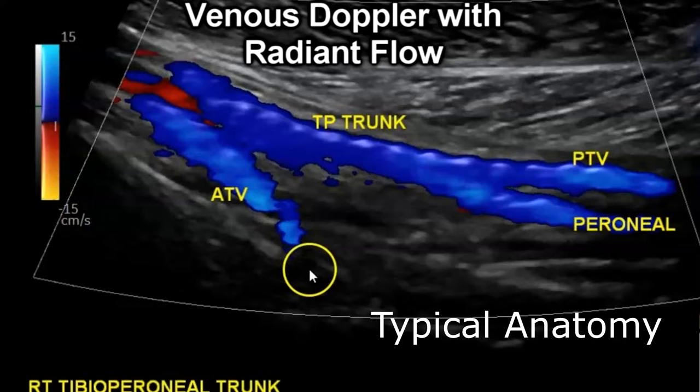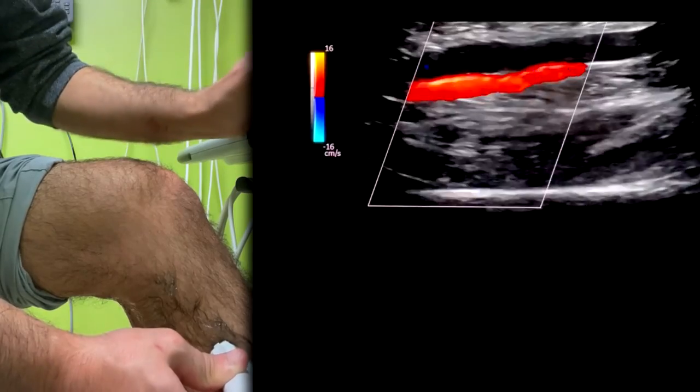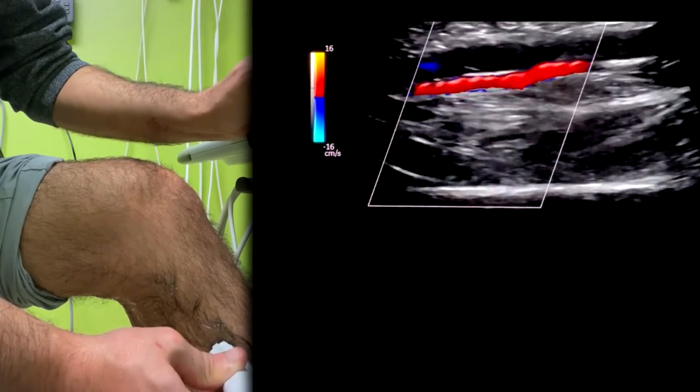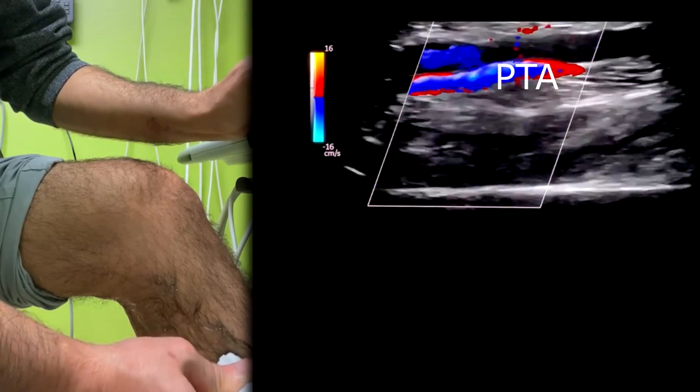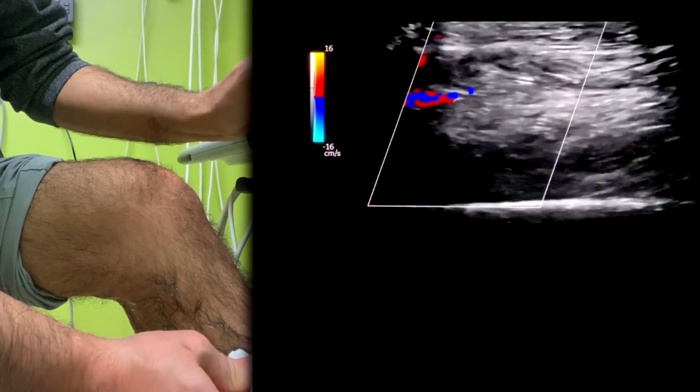Using the 9L, I'm going to go into the medial calf, angle towards the tibia, and you should be able to see all four vessels and the two arteries there. That's the posterior tibial artery there, and if you go a little bit forward and angle a little bit back you should be able to get both vessels.